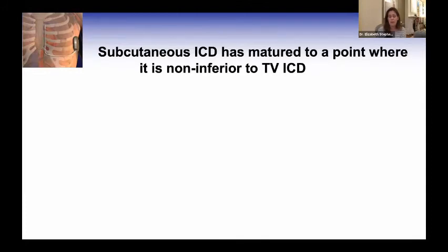to the transvenous ICD, although anybody on the Heart Rhythm website would have seen that there is a new advisory for the subcutaneous ICD that just came out today. So we are still on the learning curve.